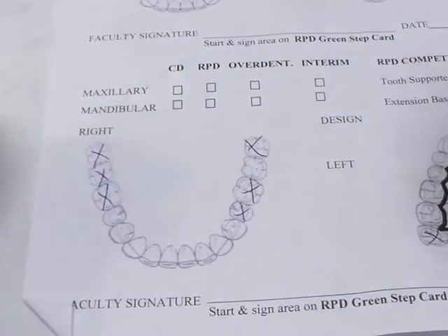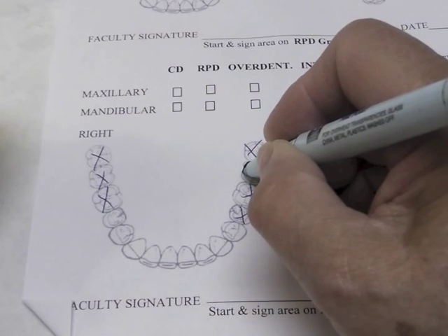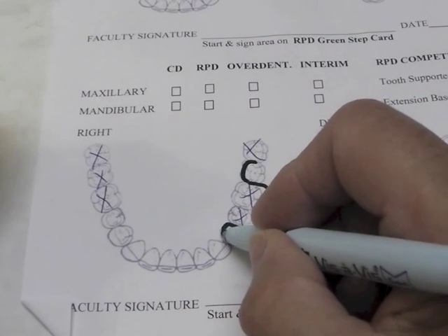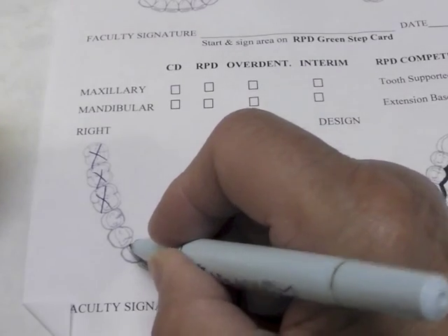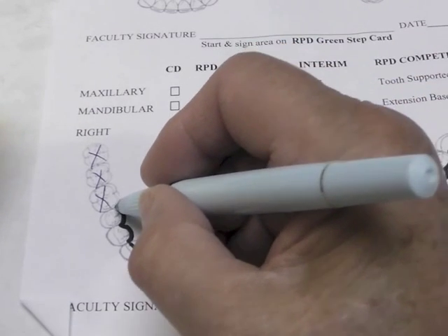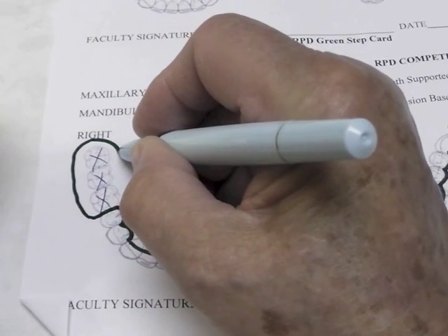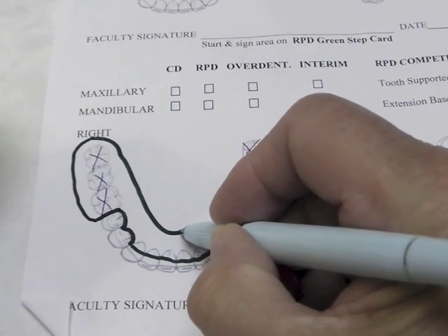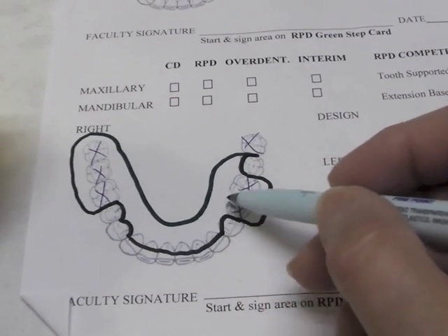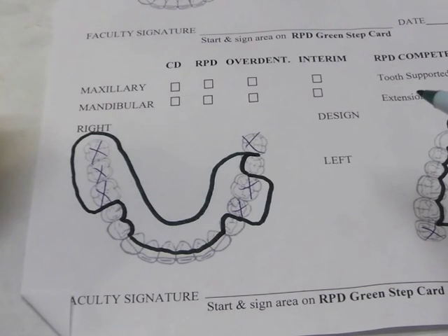I've crossed off the teeth I'm going to use. My general design would be that my base plate will come along here, plate that tooth, come down with a flange to the depth of the vestibule. I'll plate that premolar and plate across the other incisors. Then I'll plate the premolar, and my flange will come down to the depth of the vestibule. It'll go around, cover my retromolar pad, and then come around with plating down to three millimeters short of the depth of the vestibule. This will be the general design for my mandibular.